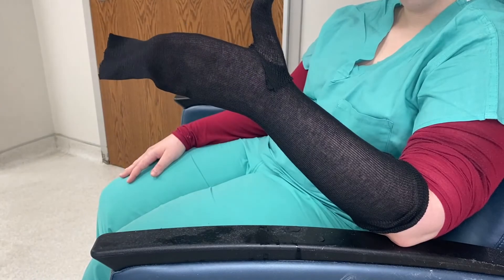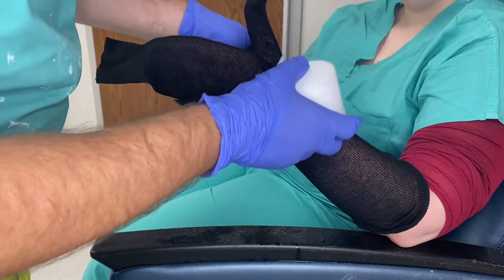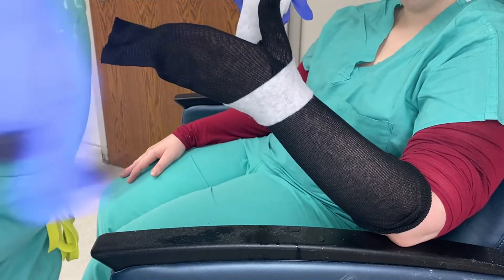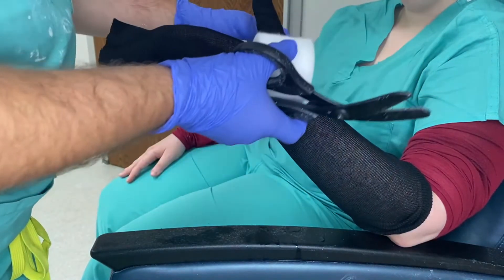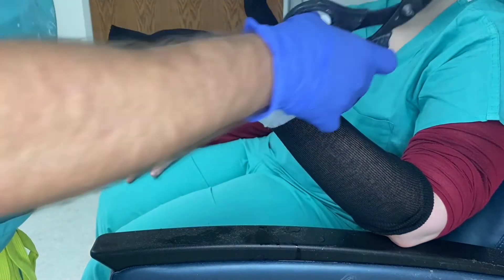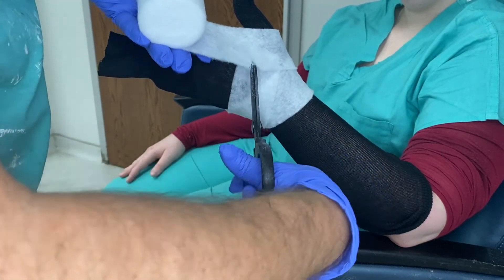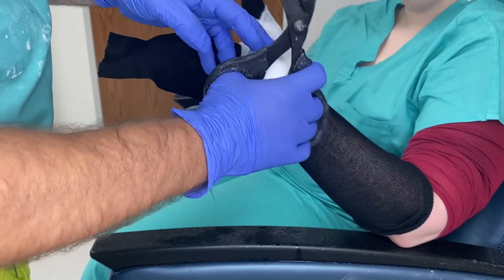Once you've done that, it's time to apply the cotton. Start at the wrist, then go around the thumb. Make a three-quarters cut, go around the base of the thumb, and then come back up. Remember, you want to cut away from the patient. Do a quarter cut right here, go around the thumb, and repeat that two more times for a total of three passes.